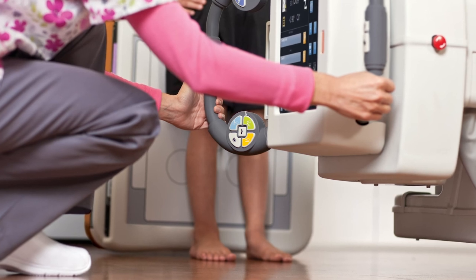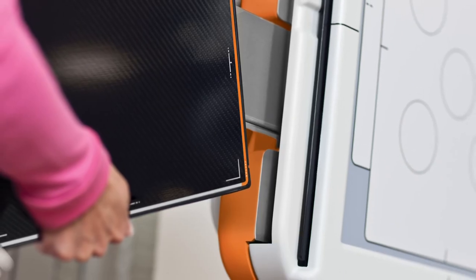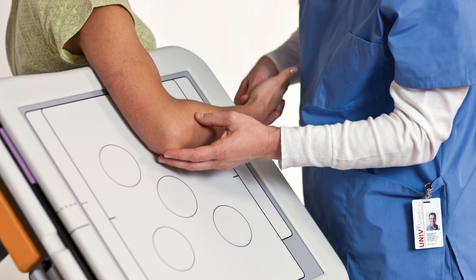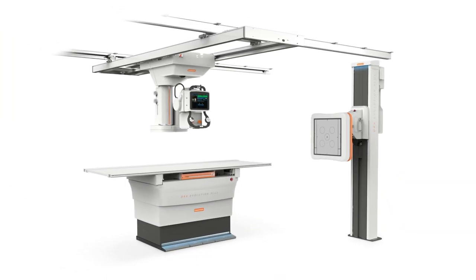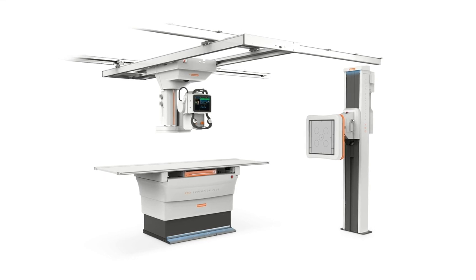Configurable components and advanced applications accommodate your needs now and move you into the future of imaging. With CareStream, you are at the center of an extensive and experienced support network that is passionately focused on your ongoing success. For more information on the DRX Evolution Plus or other CareStream products, contact your local CareStream representative or visit us at CareStream.com.